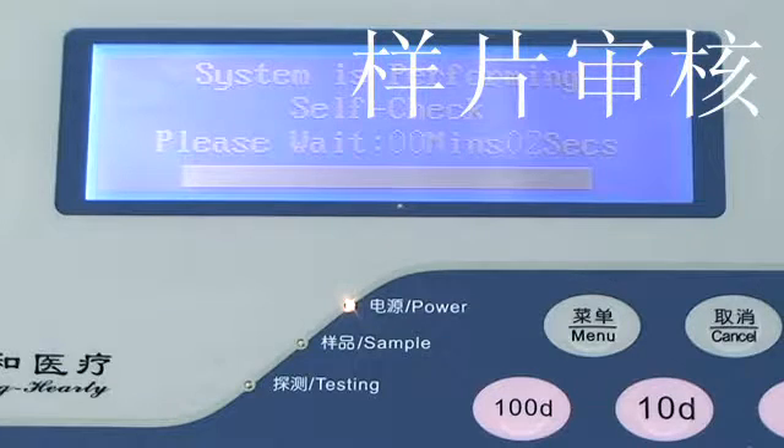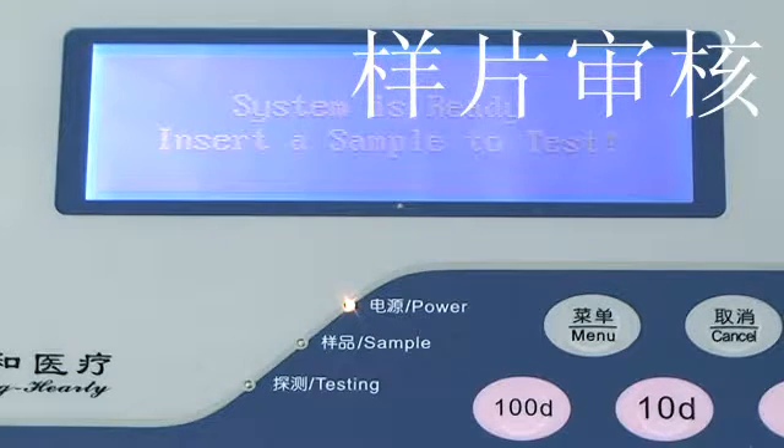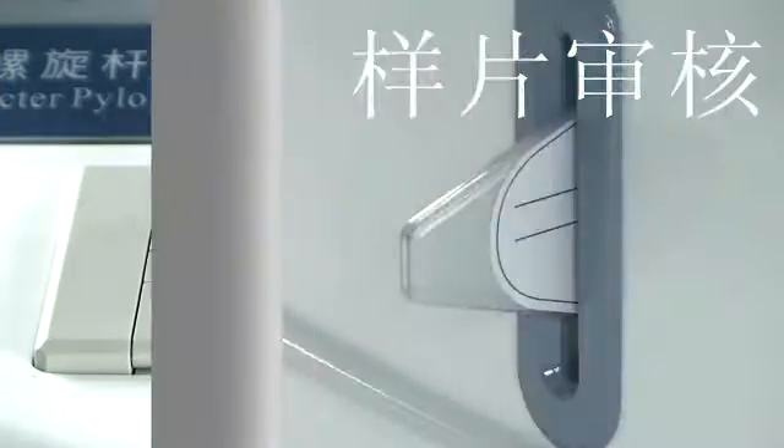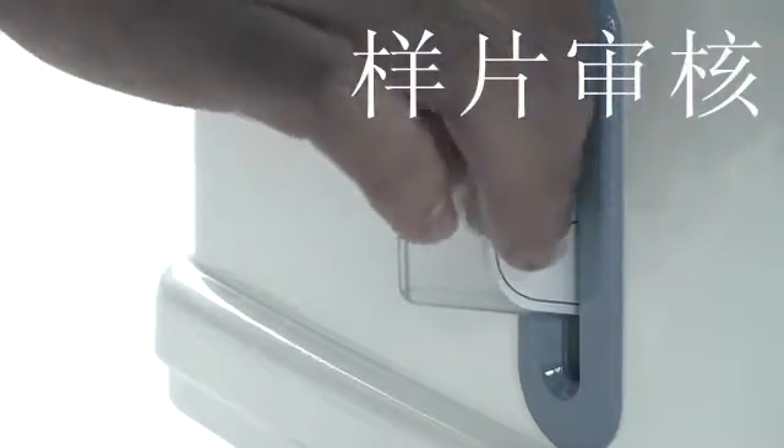When the test sample reaches the set measurement time, the test result will be printed out through the built-in mini printer, including the sample number, DPM value, and negative or positive result.